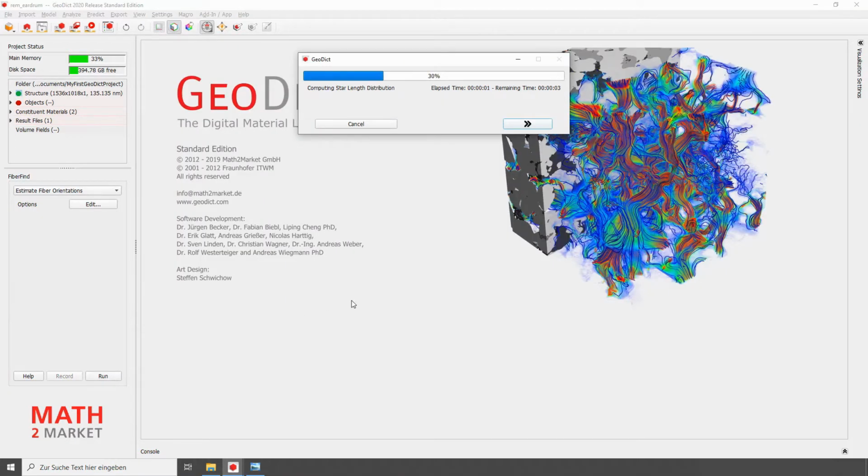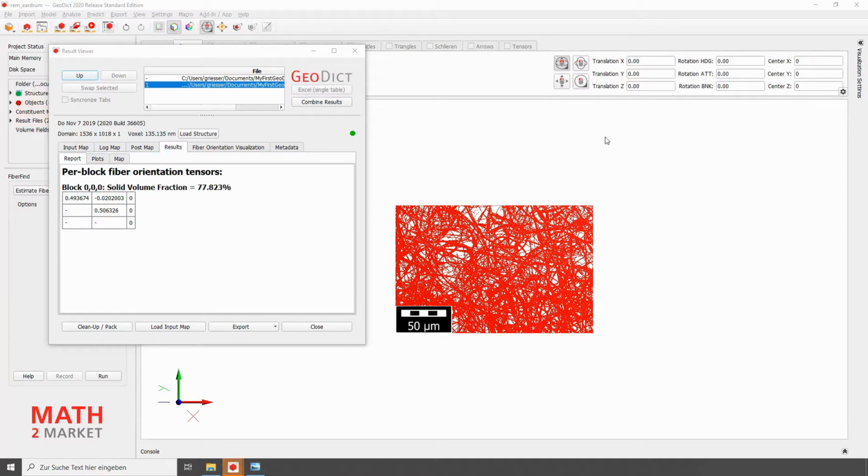GeoDict now calculates the orientation of the fibers in our image. We can use the results later as an input parameter for FiberGeo. Now we have here an orientation tensor which we will use later.